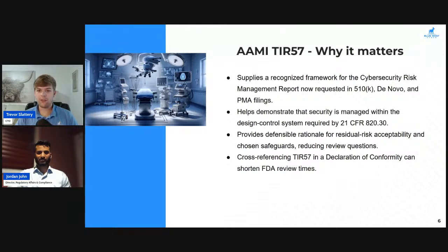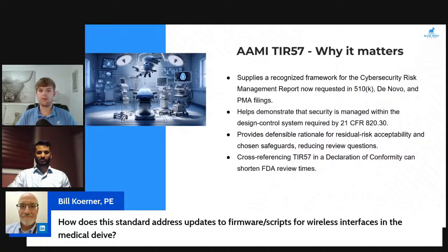All right, I see we had a question come in. How does this standard address updates to firmware or scripts for wireless interfaces in the medical device? So this standard specifically is meant to be very generalized. It's looking at what the actual process is for identifying a vulnerability or a specific flaw. So if we're looking at an update process, we might consider, what does the update flow look like?